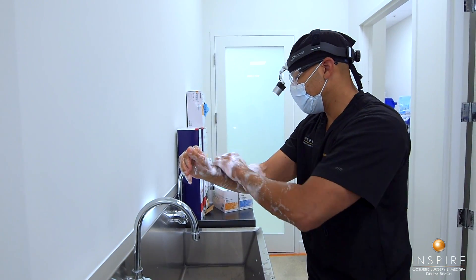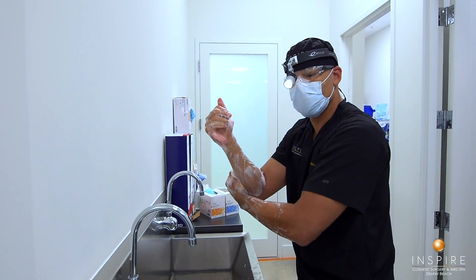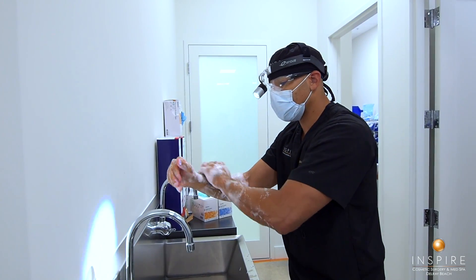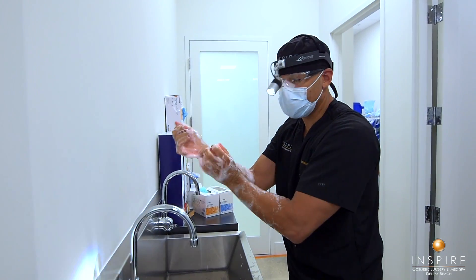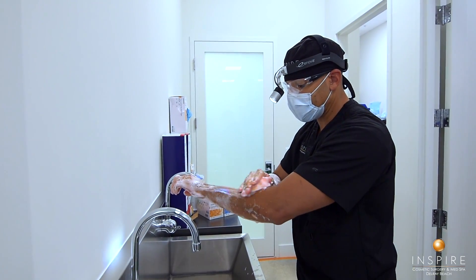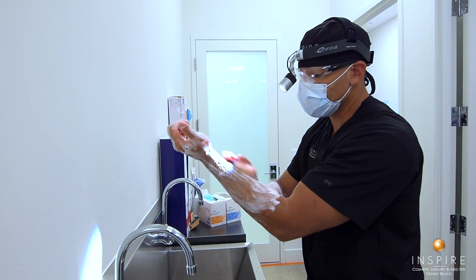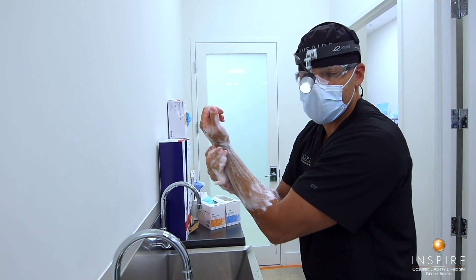One thing that's important in doing a breast augmentation is to prevent contamination of the implant. We want to avoid infection of any foreign body we put into the body, like a breast implant, and this is sometimes the cause of capsule contracture, which is one of the complications that can happen in a breast augmentation.